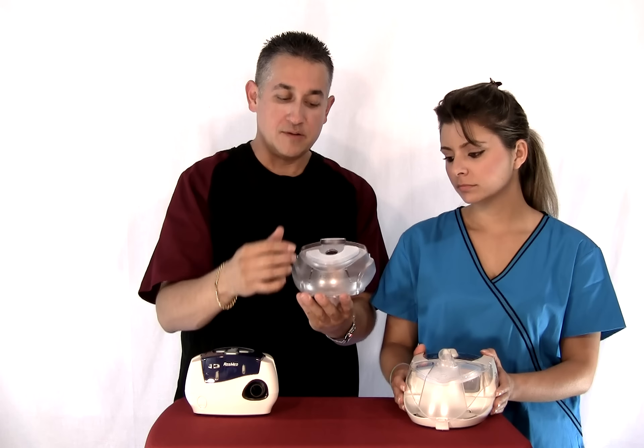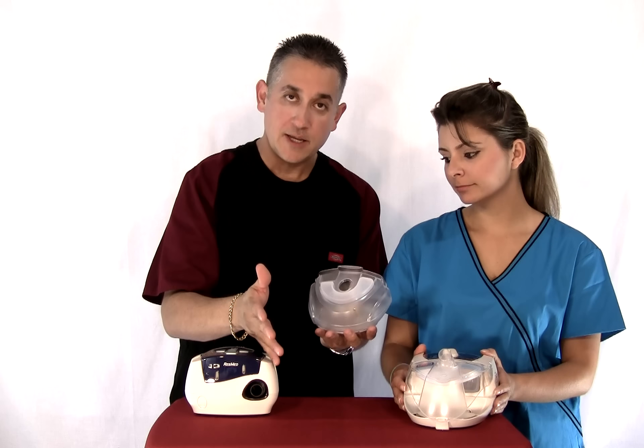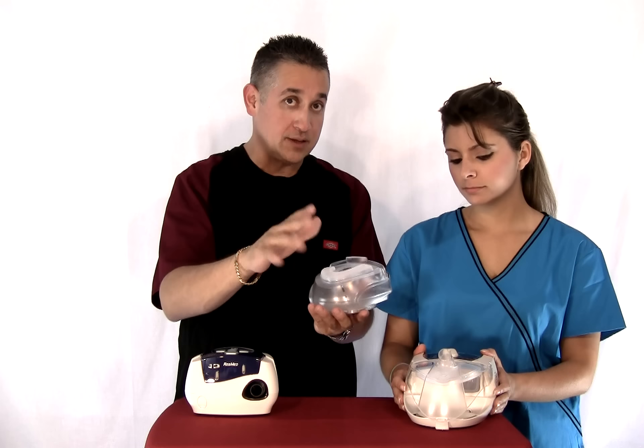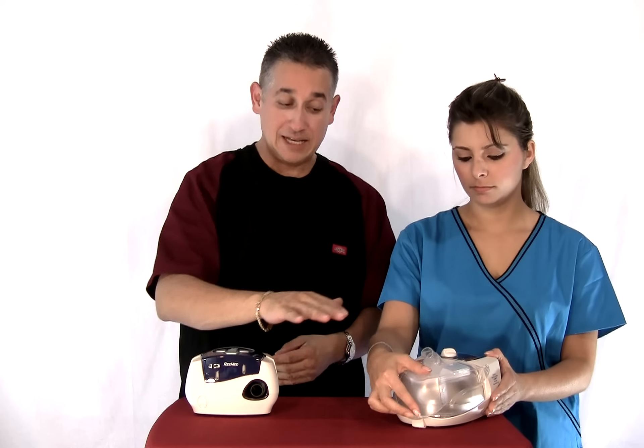You want to use distilled water because it just keeps the environment cleaner. You never want to use tap water. If you're traveling, you could put filtered water or bottled water, but make that just a temporary situation. Put that there, click that down, making sure it goes click.